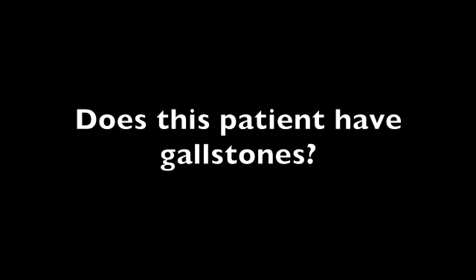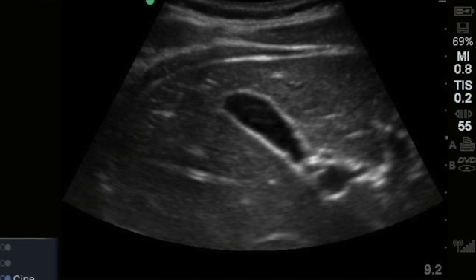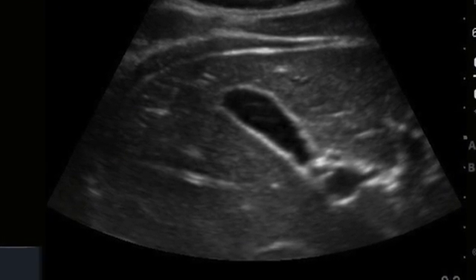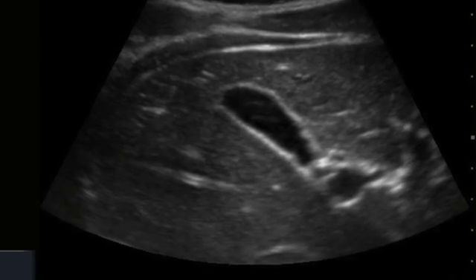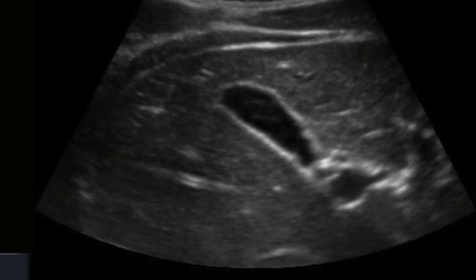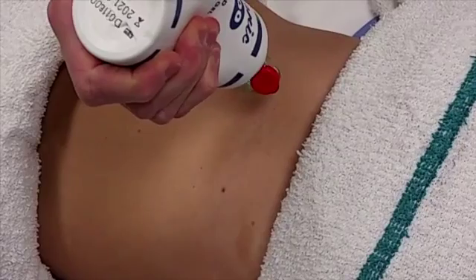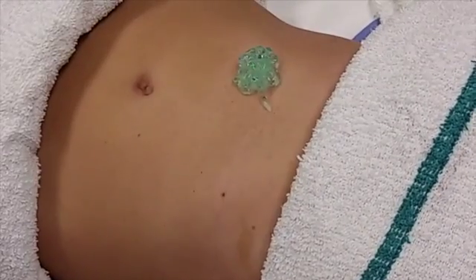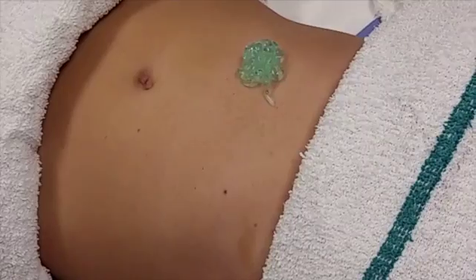This is another bit of ultrasound with Z. This time, does this patient have gallstones? Ultrasounding the gallbladder is tricky. This little sack of bile is variable in size and orientation. There are a lot of ways of doing this, but I'm going to tell you the best way.